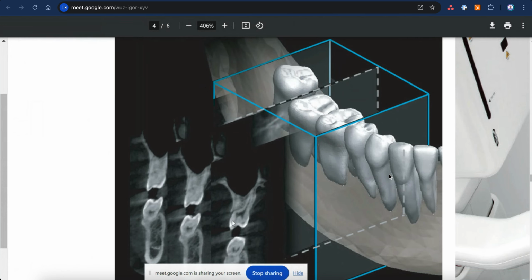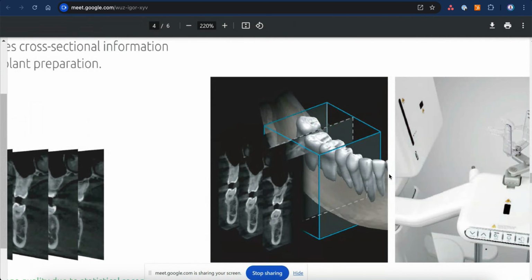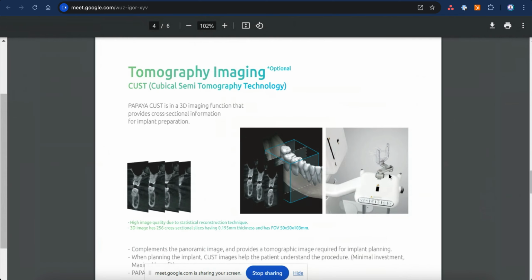And then I can decide exactly where I should put the implant, or whether there is something wrong with the root filling treatment; I can discover it this way. Because if I use the panorama, the one I showed before, or the bite wing, it doesn't show anything. But with this cross section, I can see the things that don't appear on these types of X-ray. So it's so important, especially for implantologists and for endodontists, for those doing the root canal treatment. Okay.